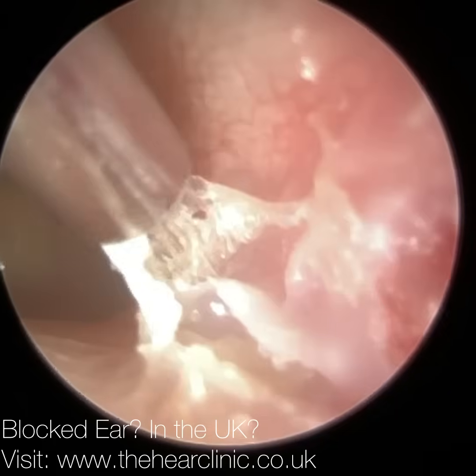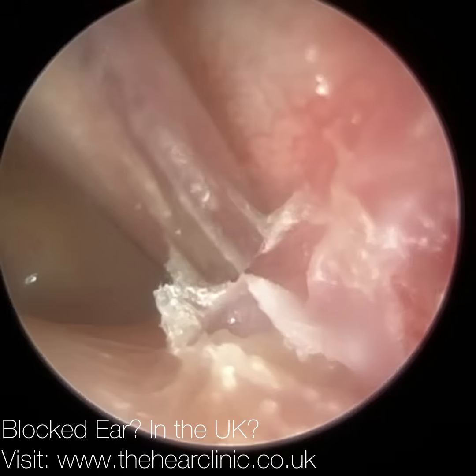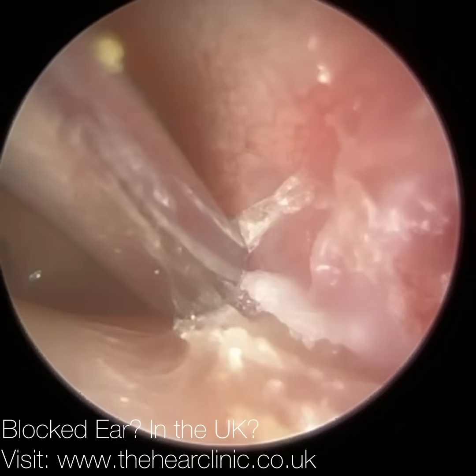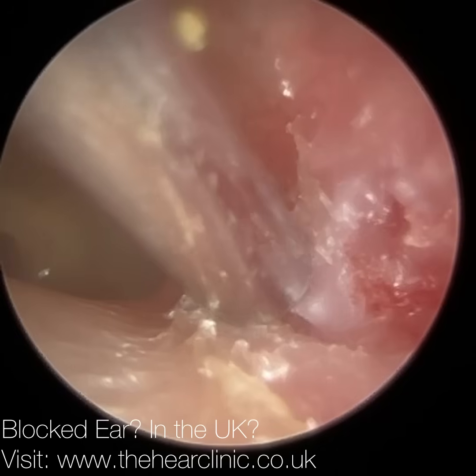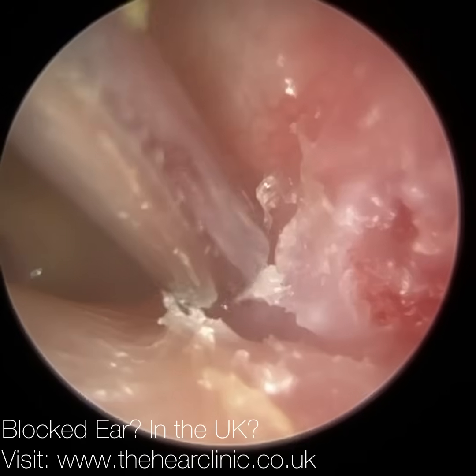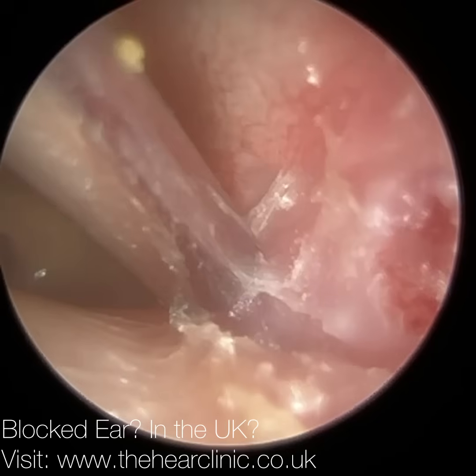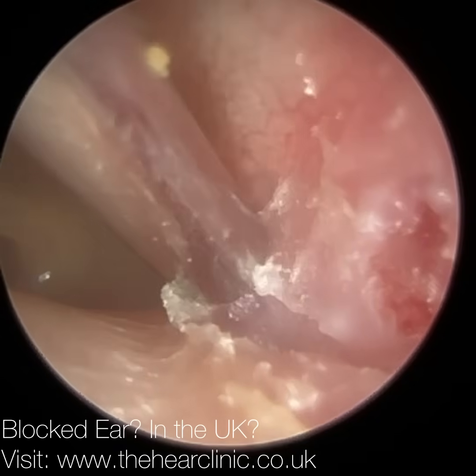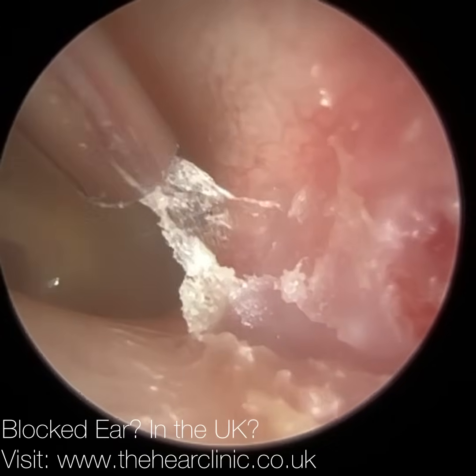It doesn't look like it's ulcerated in that beginning region, but just where I am now it looks like there's some exposed bone in that region potentially — but it could be some soft keratin. So I'm just going to suction in. I think there's some soft keratin underneath, and once I remove that the skin doesn't look ulcerated. So the skin's not missing, meaning there's no underlying exposed bone.